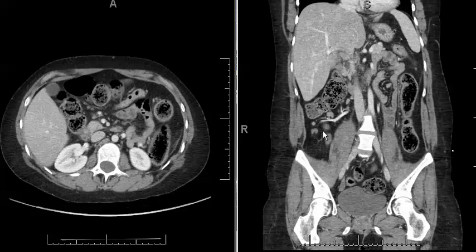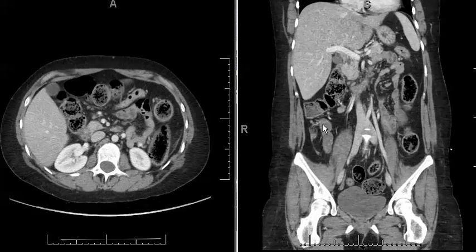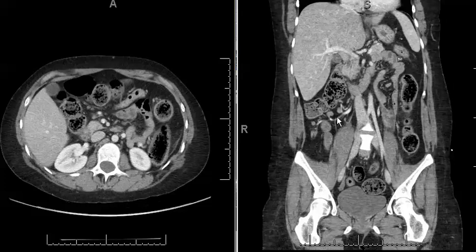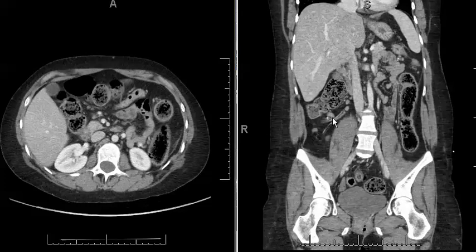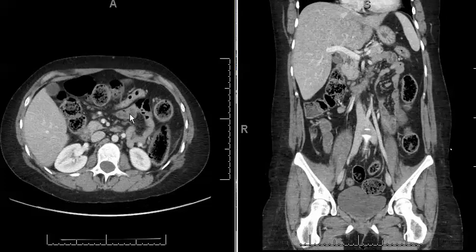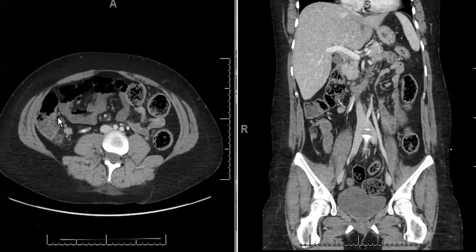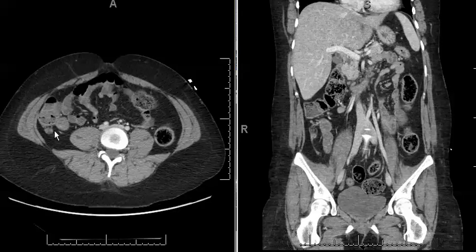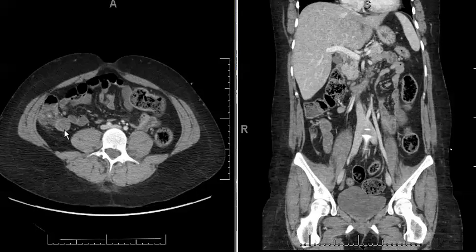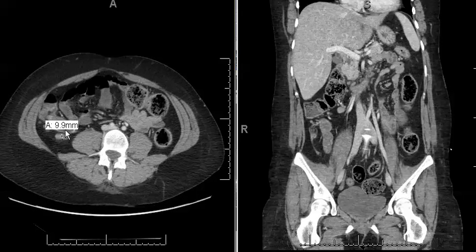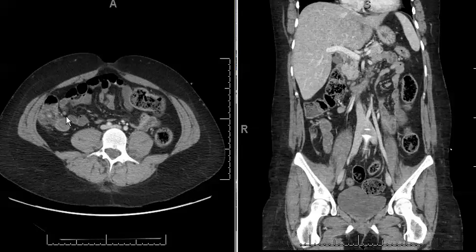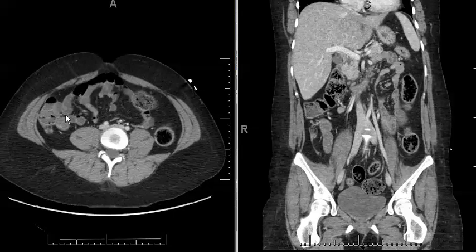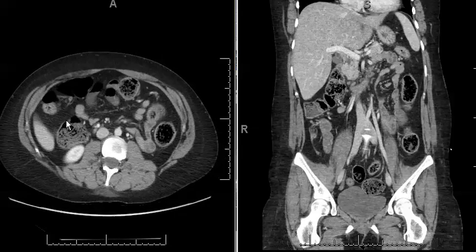However, we notice that there are multiple prominent mesenteric lymph nodes seen here along the ileal mesentery in the right lower quadrant of the abdomen. Some of these measure up to one centimeter. Corroborating that on the axial plane, we again see multiple lymph nodes in the right lower quadrant of the abdomen.